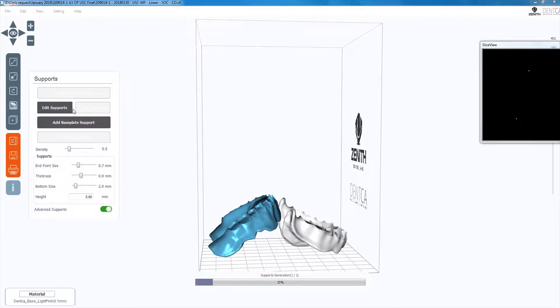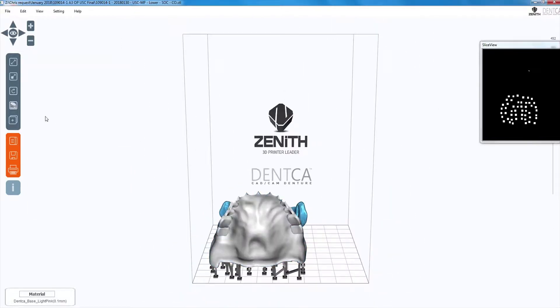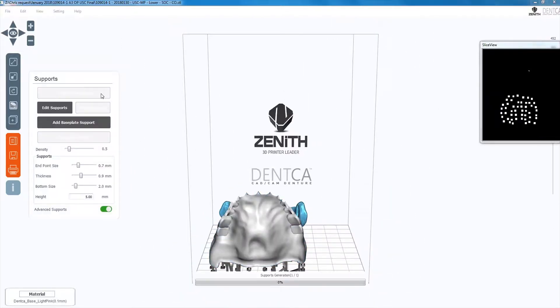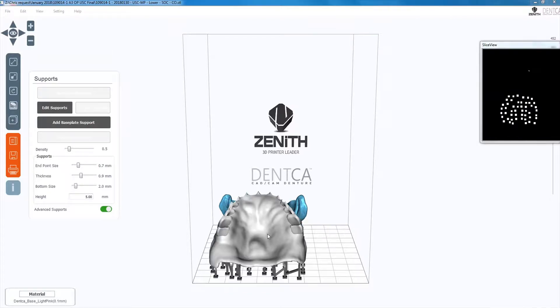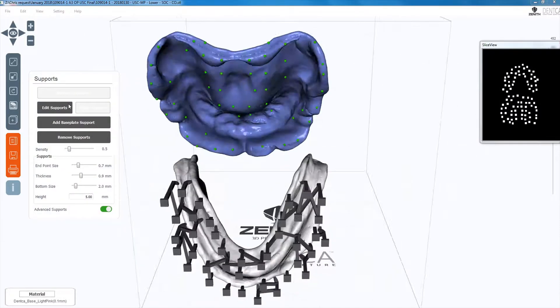After positioning, click on the button below the curved arrow to generate the support. It's important to adjust the values for density, height, and thickness to the ones shown on the screen. Making them too long can increase the printing time. Once ready, click on generate supports.